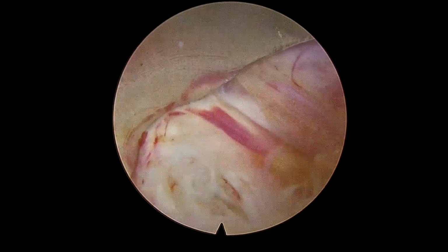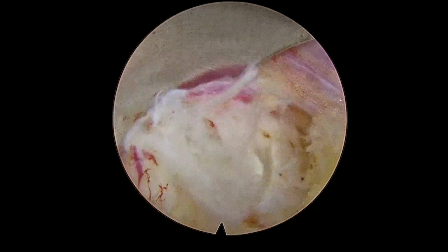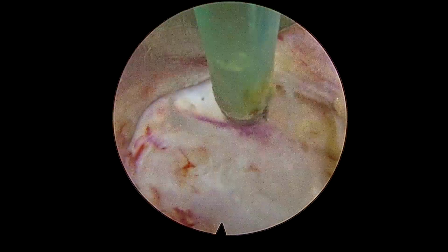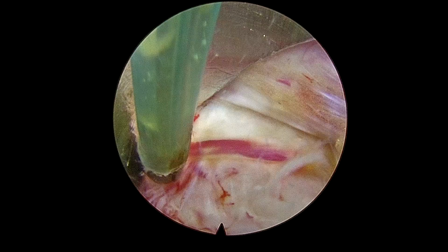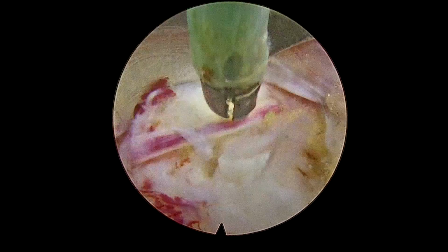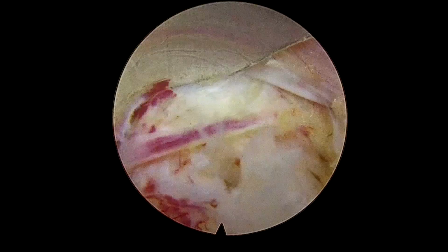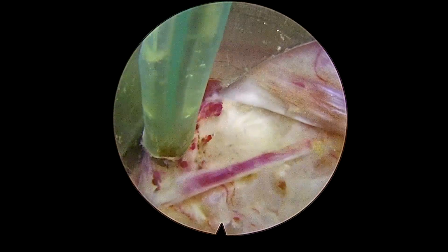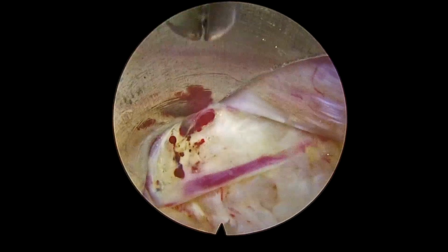So these are some free fragments which are coming out of the disc space. So again, achieving hemostasis is very important. Once the epidural vessels start bleeding, it becomes very difficult to control them. So it is always advisable, whenever you see them, coagulate them.